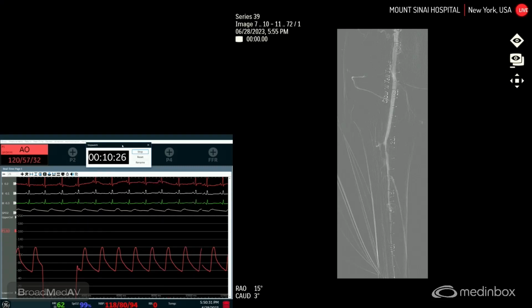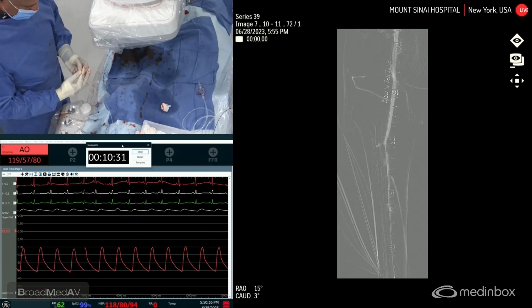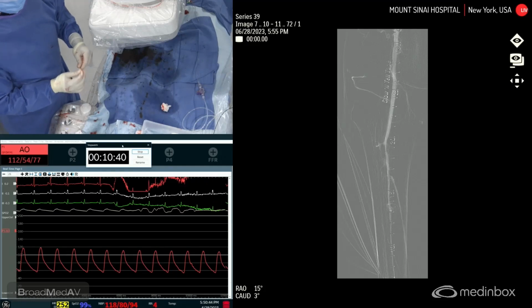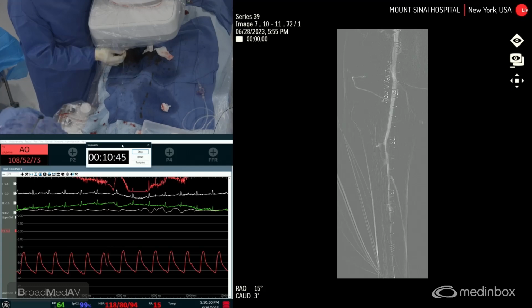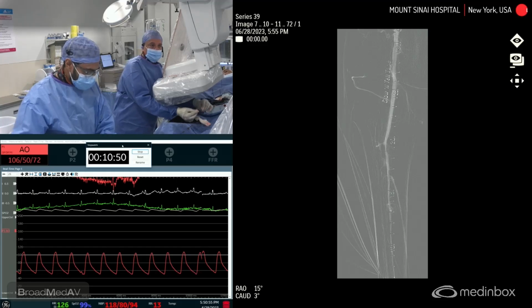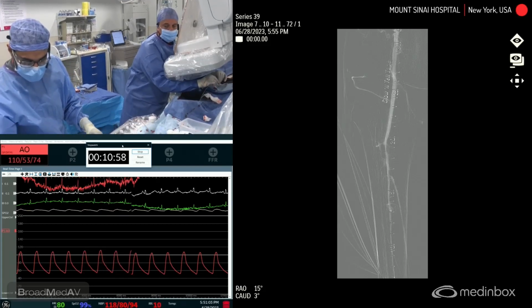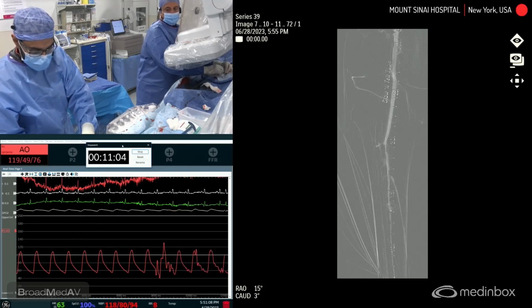So maybe you can talk about the mechanism of how this balloon works and how you're supposed to use it, Ibrahim. Yeah, so it has little blades on it, almost like a Wolverine balloon for the coronaries. It has 3 blades around it, and we inflate it to an atmosphere of 4 to bring out the blades and not fully inflate the balloon, and that just gives a little bit of serration, so to speak, to the vessel. And then when we inflate it all the way to 6, which is its nominal pressure, then it expands out the vessel. And the thought is by creating those serrations, you dissect the vessel somewhat less by getting a nice equal expansion of the vessel.